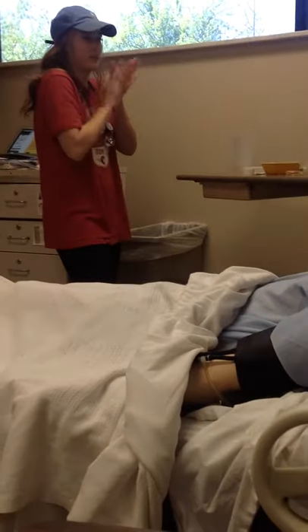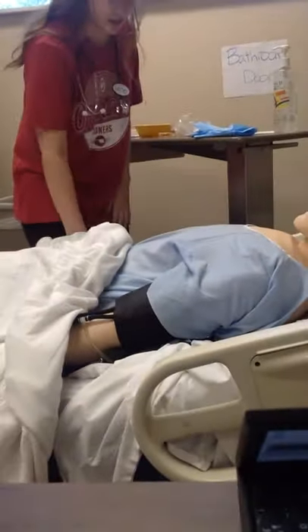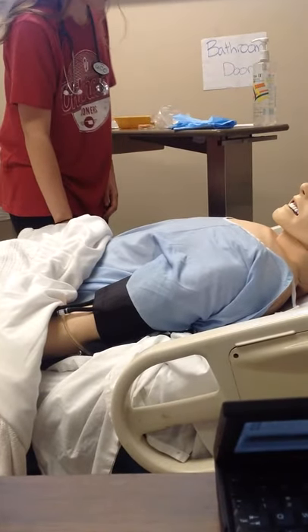Come on in. Hi, my name is Sarah. I'm going to be a student nurse today. I'm just going to perform hand hygiene. And I'm going to check your ID band. Can you tell me your name and date of birth for me, please? John Smith, 11XX.